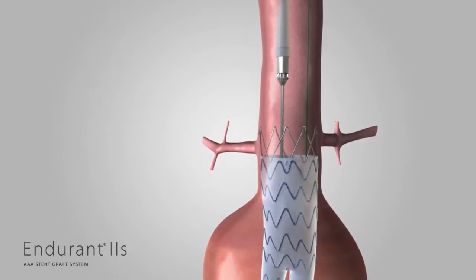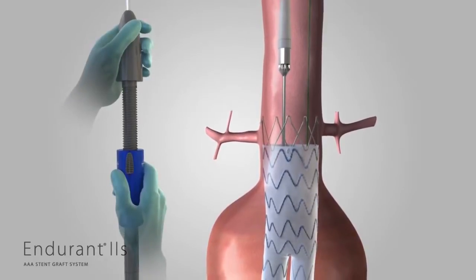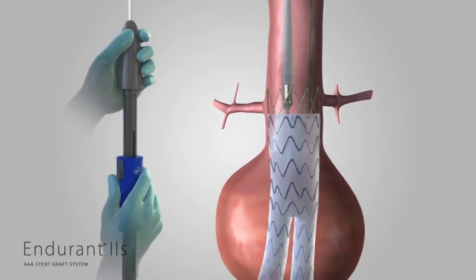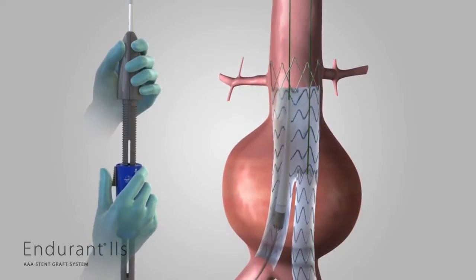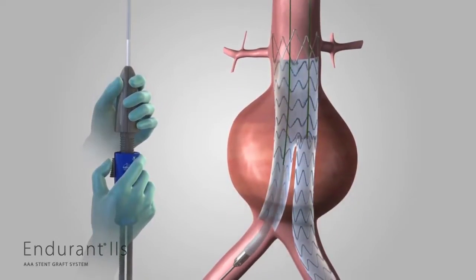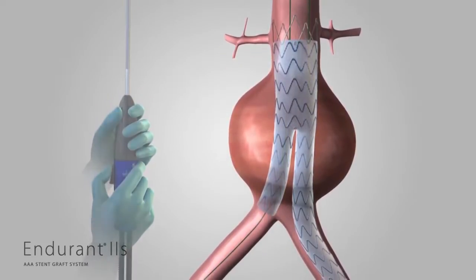To configure for removal, continue to hold the delivery system with one hand on the front grip and the other on the slider. Gently torque and withdraw the delivery system counterclockwise until the spindle is retracted into the fabric portion of the stent graft. Pull back the slider trigger and hold the slider stationary while bringing the front grip to the slider. Gently remove the delivery system using fluoroscopy to ensure that the stent graft does not move during withdrawal.